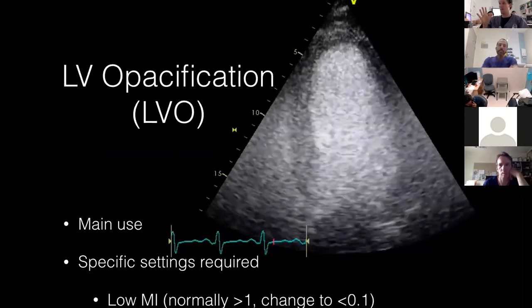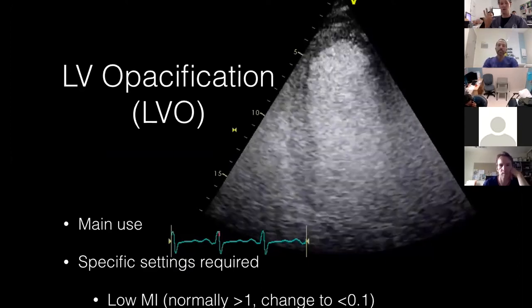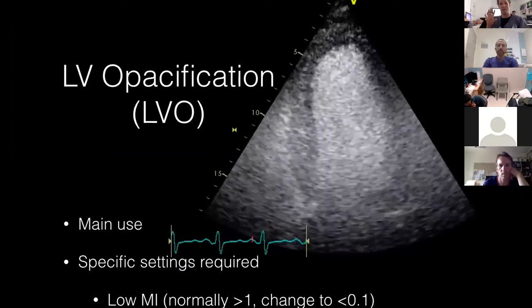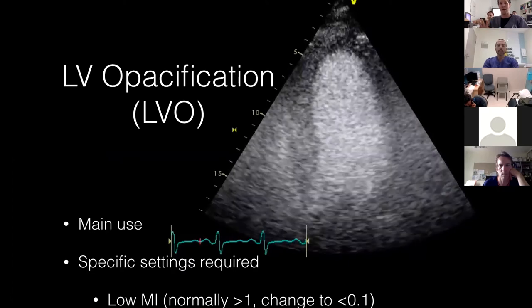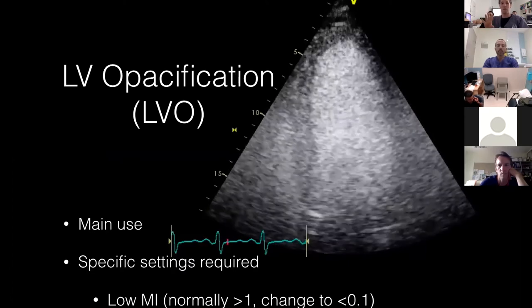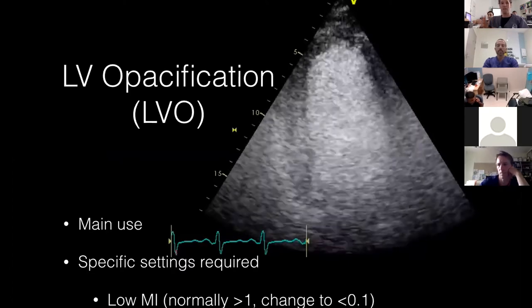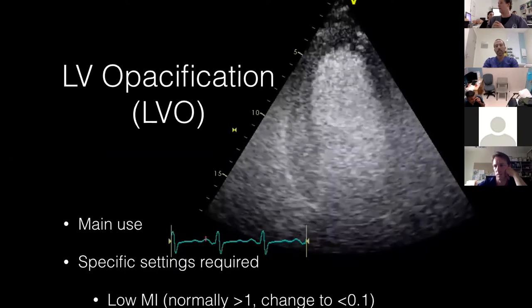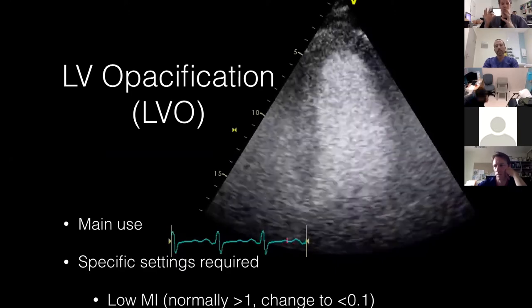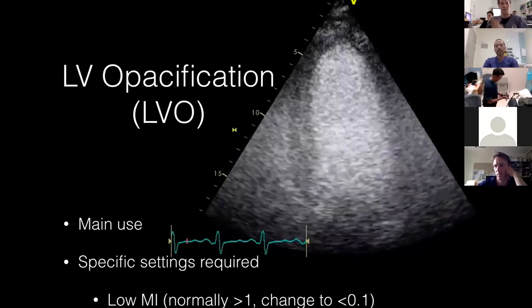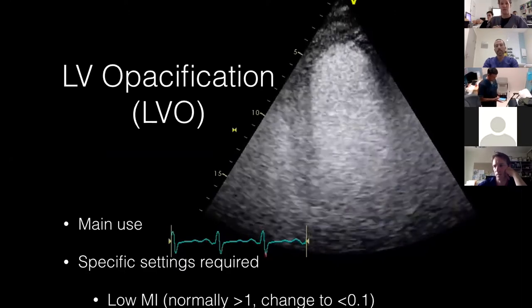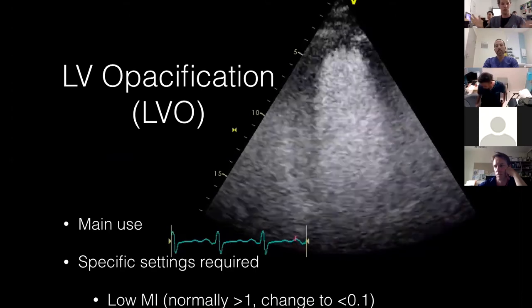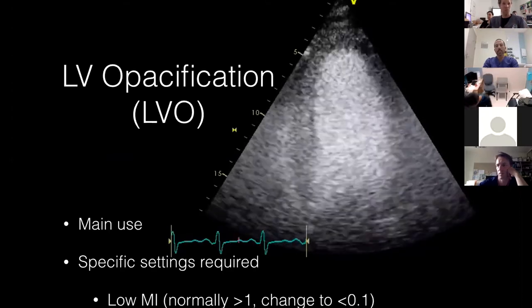With this low mechanical index — about 10% of normal ultrasound power — the inside of the LV lights up bright white because of all the sound waves reflected back. This helps you look for thrombus, which is the main indication.